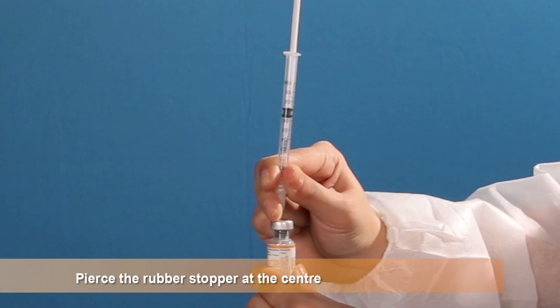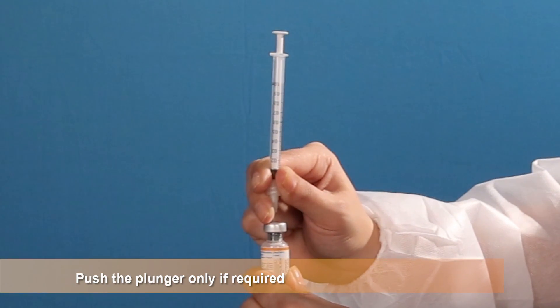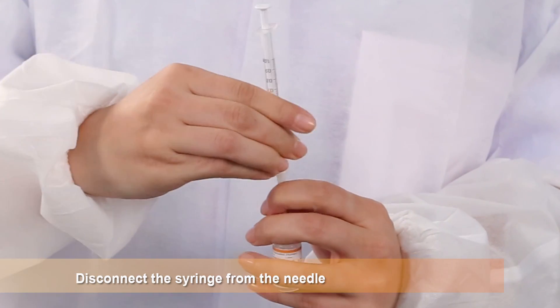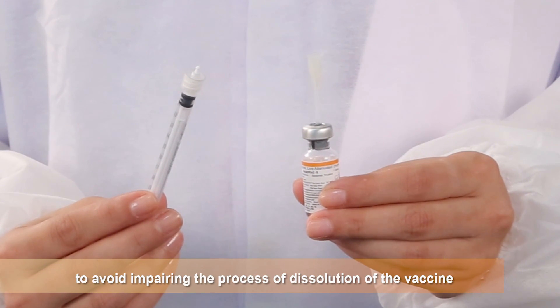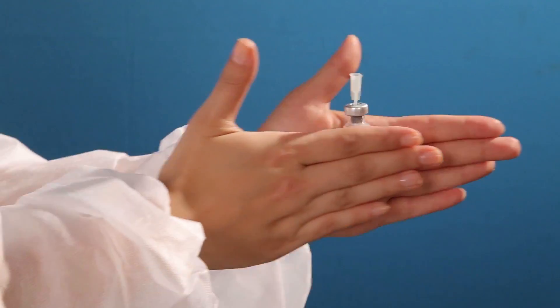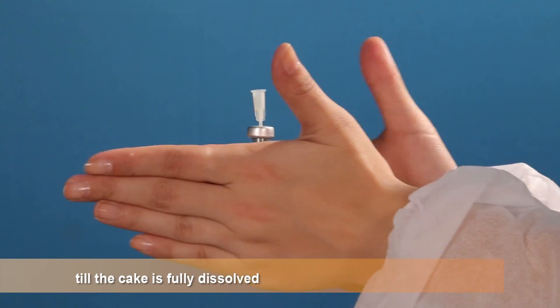Pierce the rubber stopper in the center. Allow the water to be drawn into the vial. Push the plunger only if required. Ensure that the entire syringe has been emptied. Disconnect the syringe from the needle to break any residual vacuum to avoid impairing the process of dissolution of the vaccine. If there is any delay in dissolution of the cake, rotate the vial gently between the palms of your hands till the cake is fully dissolved.